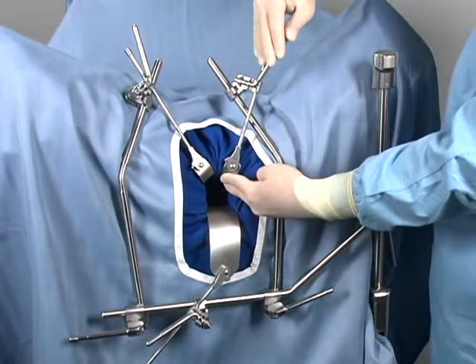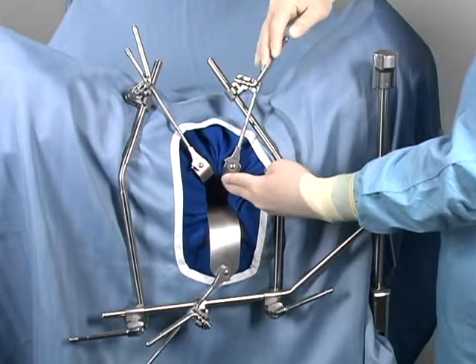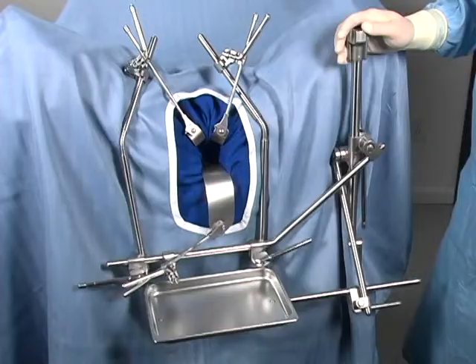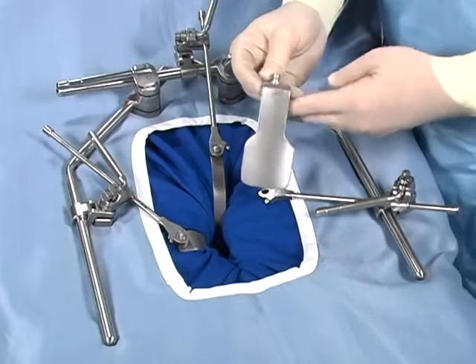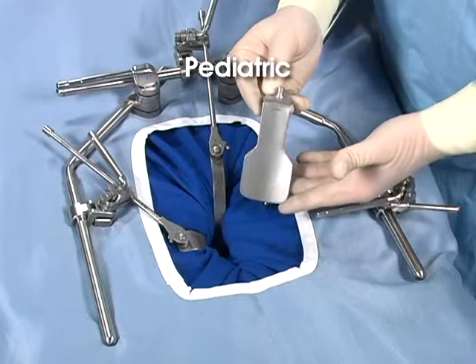The swivel feature allows a blade to be positioned for elevation, giving the surgeon uncompromised, hands-free exposure. Many GYN surgeons prefer using the stainless steel tray that is easily attached to the rail clamp. By adding smaller retractors, this frame will accommodate pediatric approaches as well.